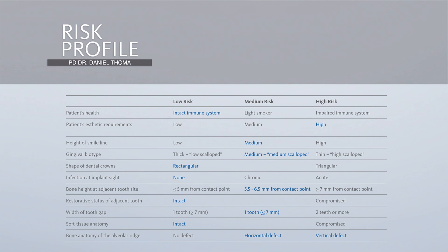The bone height at the adjacent tooth site ranges between 5.5 and 6.5 mm from the contact point, which is of medium risk. The restorative states of the adjacent teeth are both intact, and looking at the width of the tooth gap, we have a distance of about 7 mm. The soft tissue anatomy is currently intact, but we do have a horizontal and vertical defect.